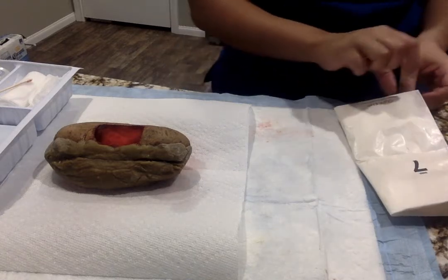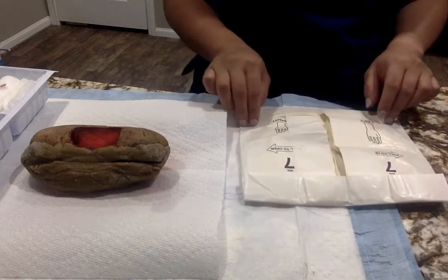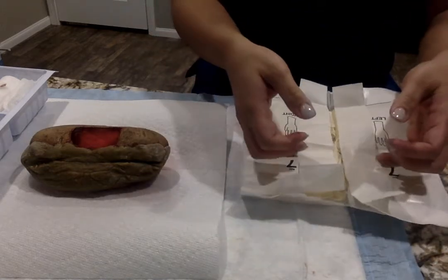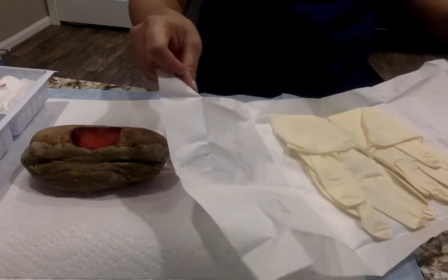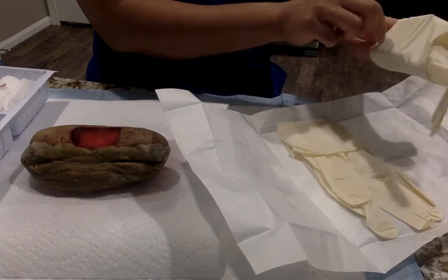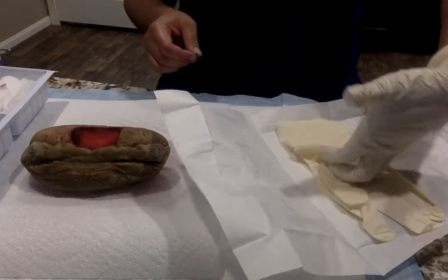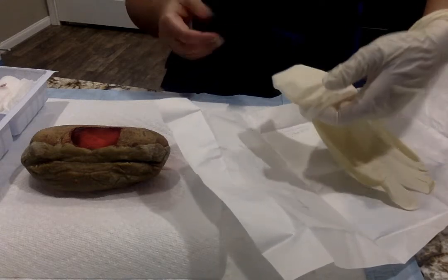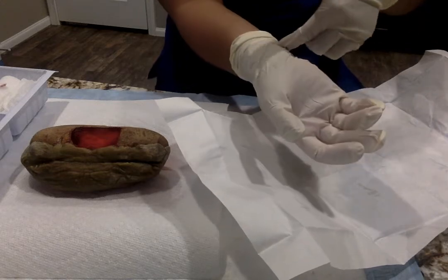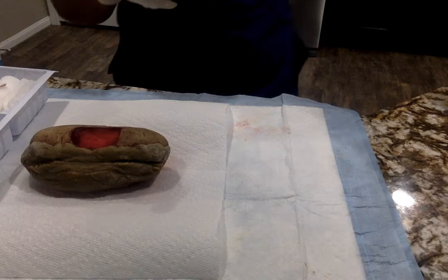Okay, so I'm going to go ahead and do my sterile gloves. I'm keeping my hands up, and I'm opening up the gloves, only touching the outsides. I'm going to pick up this glove and put it on. Readjusting the fold, I'm going to grab this one with my thumb out and scooping in the inside and putting my hands in. My thumbs are out. I was touching the outside of that, so I'm going to leave it. And I'm going to pick up the middle of this and take the sterile out of the way.